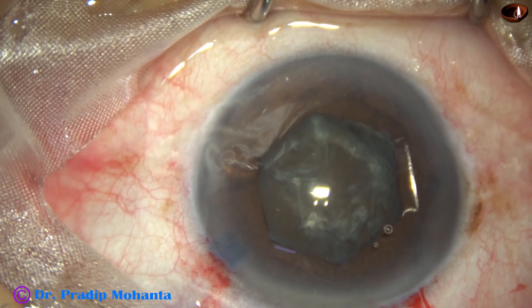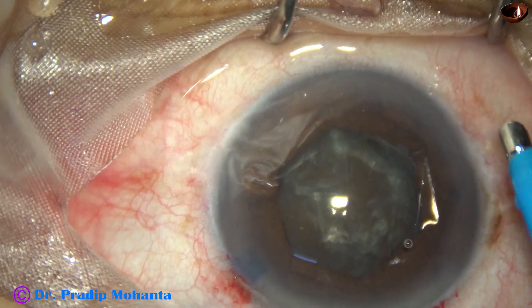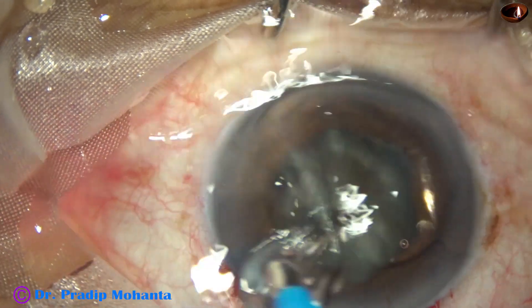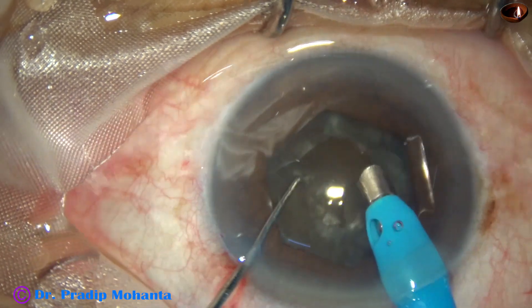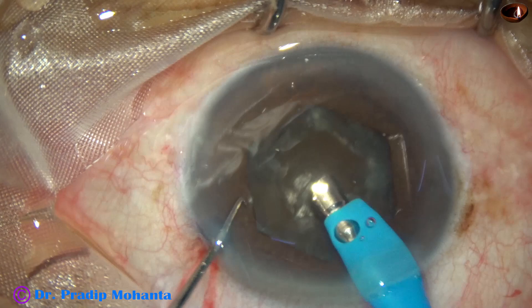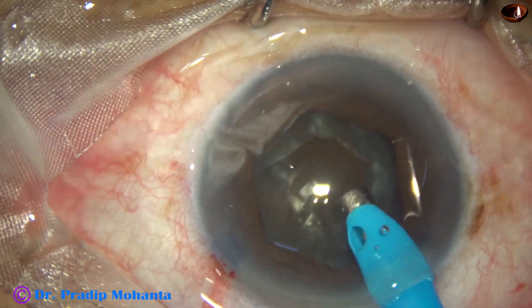The machine being used is Oertly Faros from Switzerland — a beautiful machine, no financial interest. In hard cataracts, if I use ultrasonic energy judiciously and don't come near the main wound, there is no wound burn. Some superficial cortical lens matter has been removed.